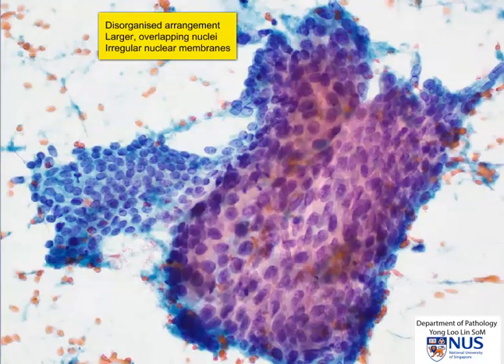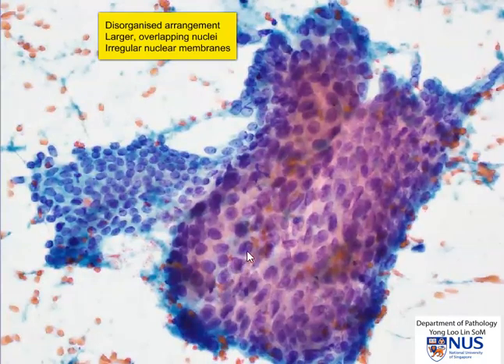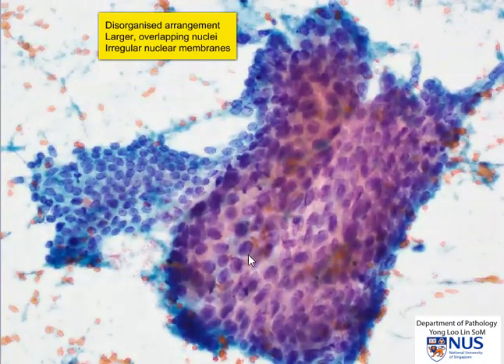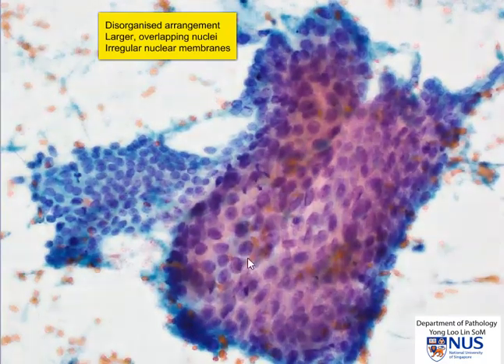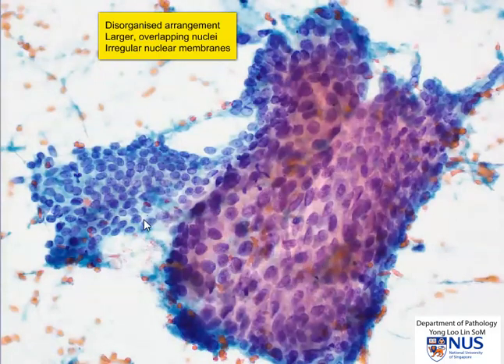Let's focus up and down. You can see that these nuclei are much larger, they are more irregular, there is more variation in nuclear size and a much greater degree of disorganization compared to this honeycomb sheet.